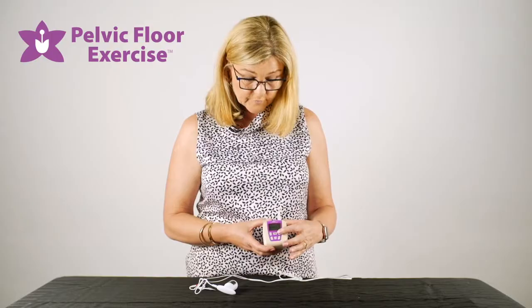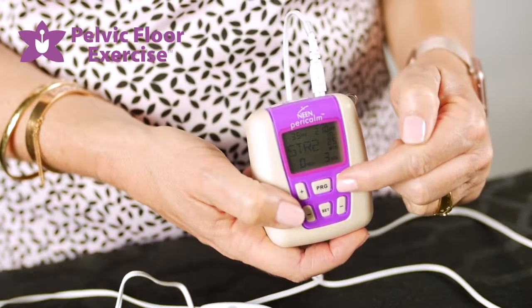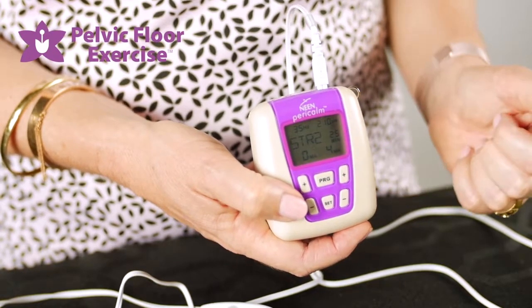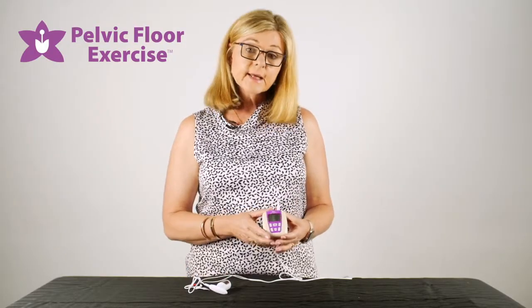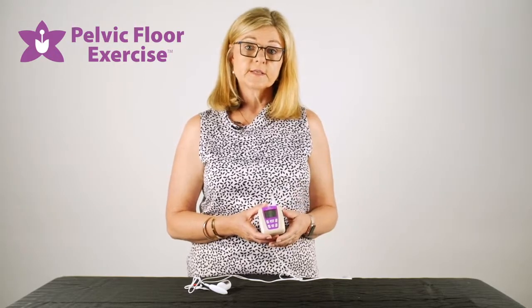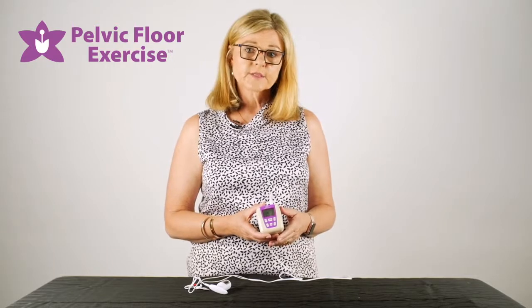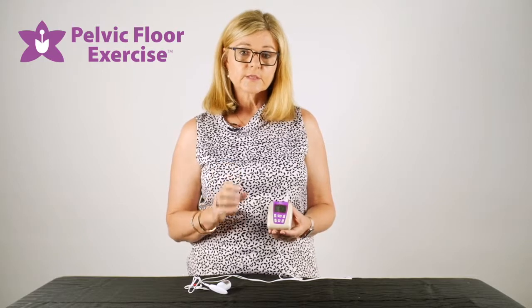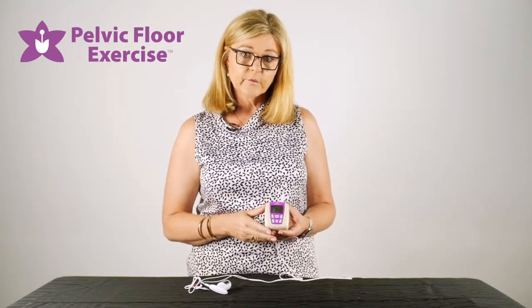Take up the milliamps or the intensity — for example, if you're on a stress incontinence program and wanting a contraction of the pelvic floor, the aim is to feel the pelvic floor contracting. It may take a couple of sessions before you feel confident enough to take the intensity up high enough to get a contraction. The first couple of sessions can just be getting used to it — it's like a pins and needles, tingly sort of sensation, but quite strong, and that's creating a contraction in the pelvic floor.